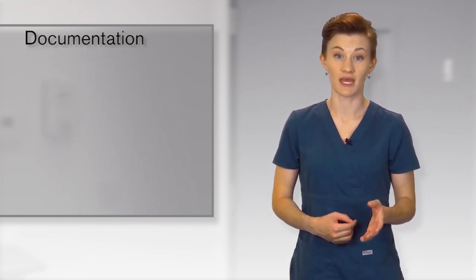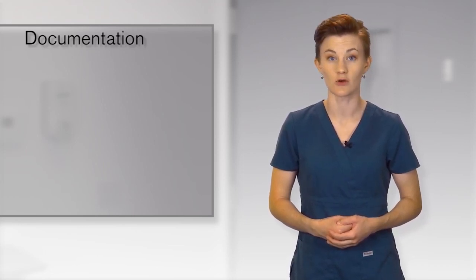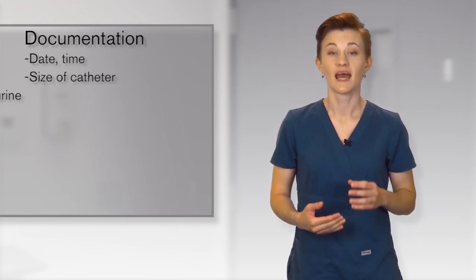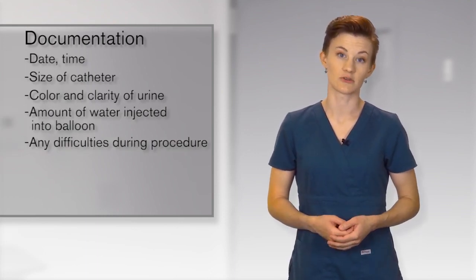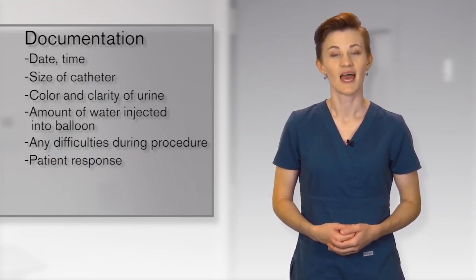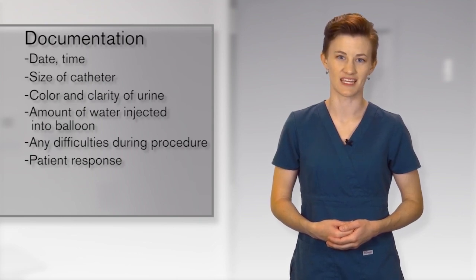Remember, you will be documenting following the procedure, so it is important to observe and take note of the date, time, size of catheter, color and clarity of urine, amount of sterile water in the balloon, any difficulties encountered during the process, as well as the patient's response. Now let's watch Christy as she performs a Foley catheterization.